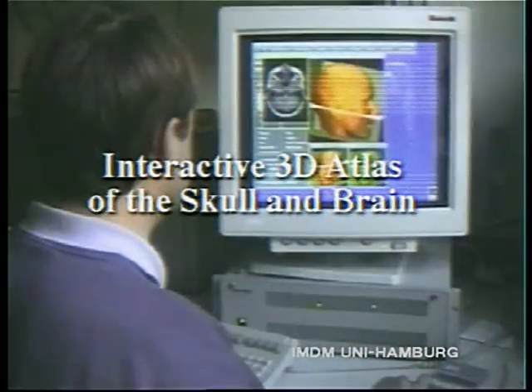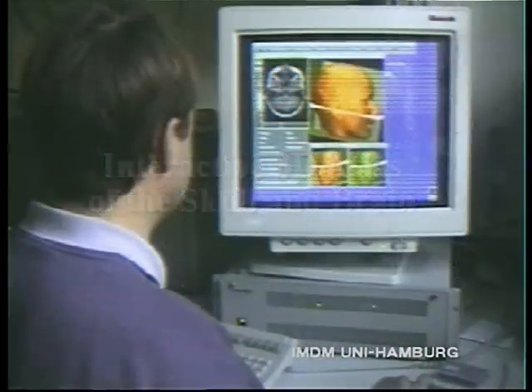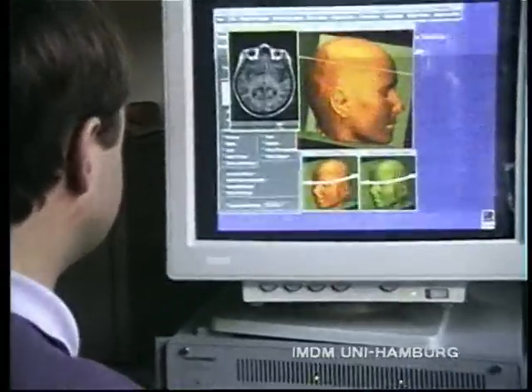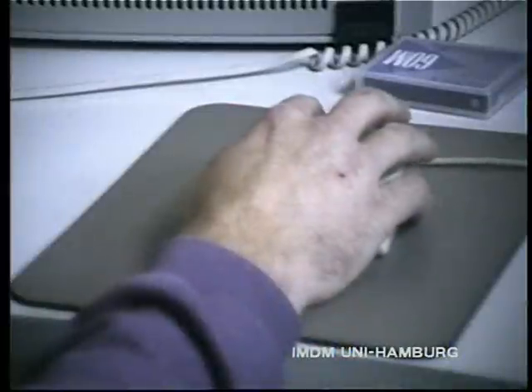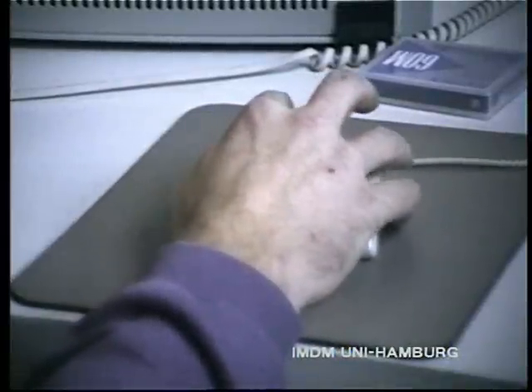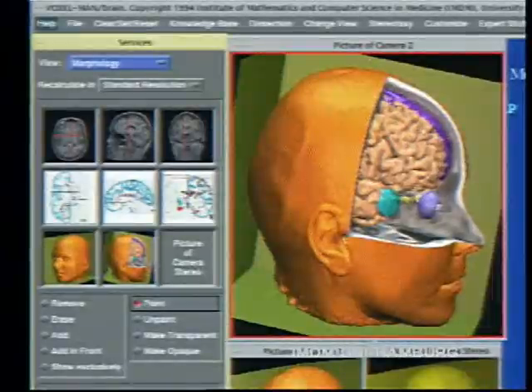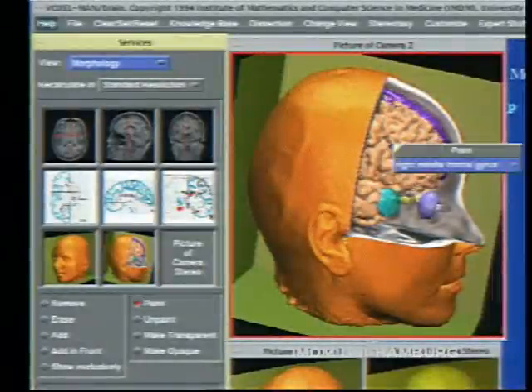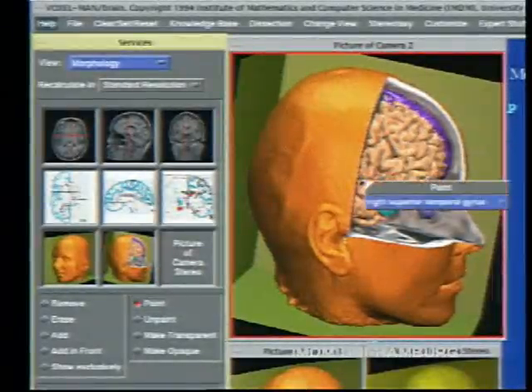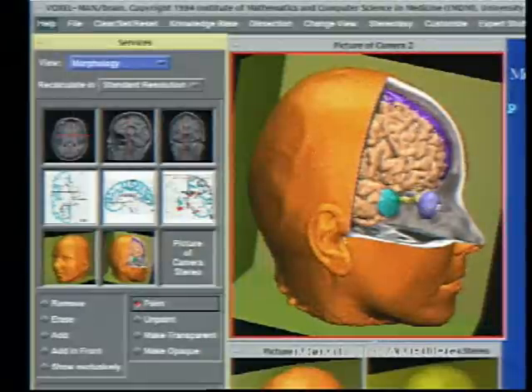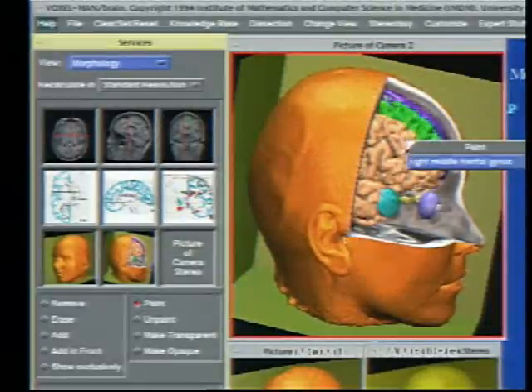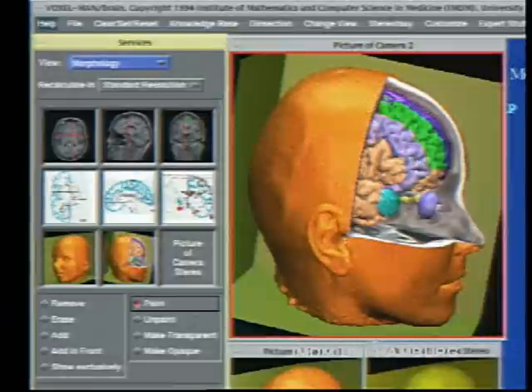A substantially new quality of virtual body models may be achieved when we link them with an anatomical knowledge base. Then it can be used for anatomical atlases such as the Voxel Man atlas of the skull and brain. We can inquire information such as anatomical names from any location and we can color mark them, for example such as these gyri here.